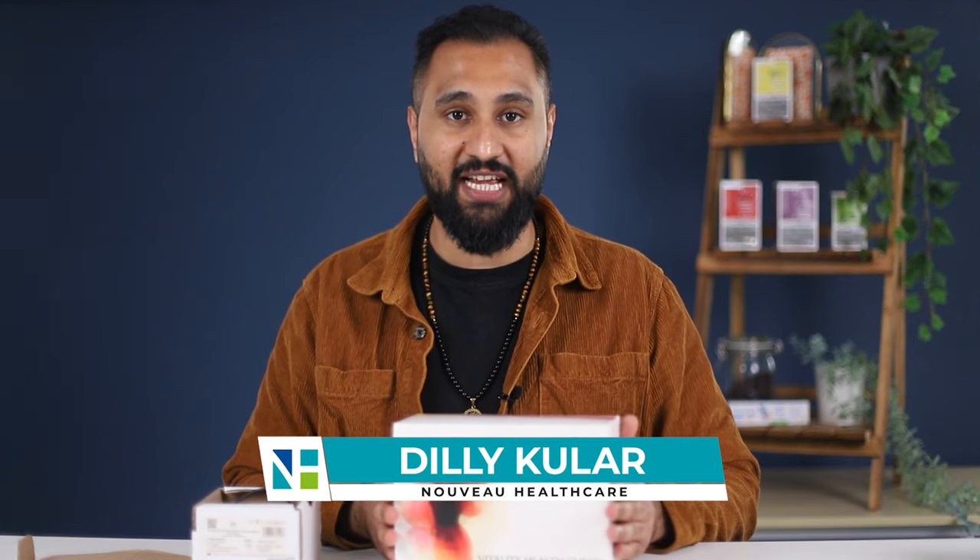If you've just purchased the vitamin D test kit that allows you to test your patient's vitamin D levels within 15 minutes, I'm actually going to show you in this video what comes in the kit and how to use it.